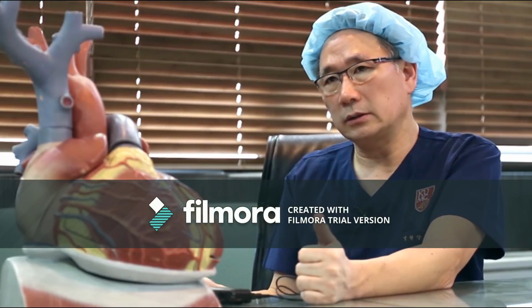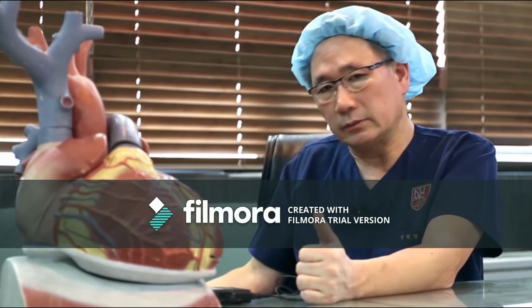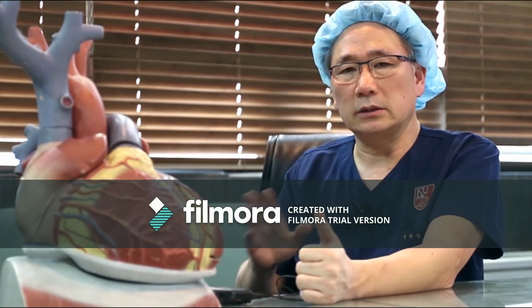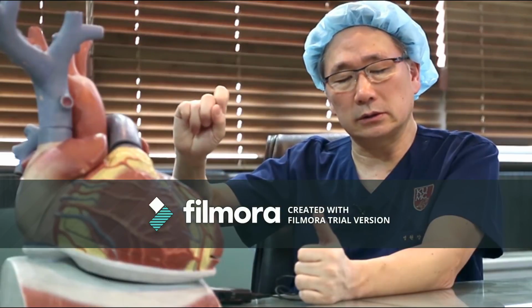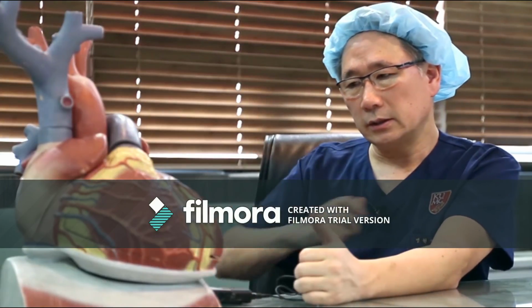That means the contrast is inside the LA and then the LV first. This is different from an aortic puncture. So make sure of the RAO view and that blood is safely withdrawn. And in some cases, you can use contrast in the RAO view.